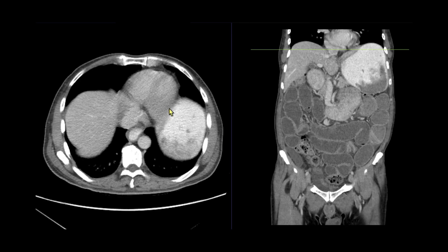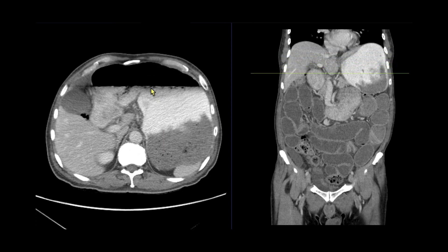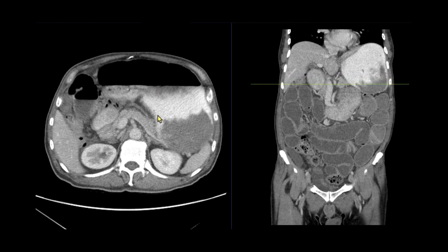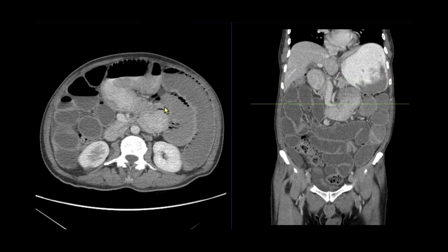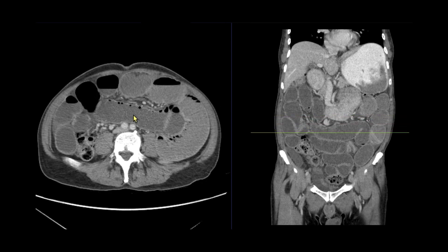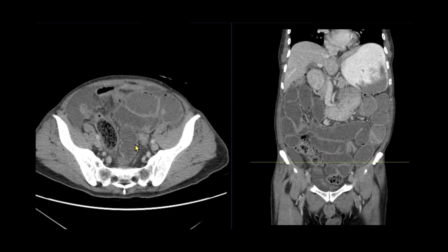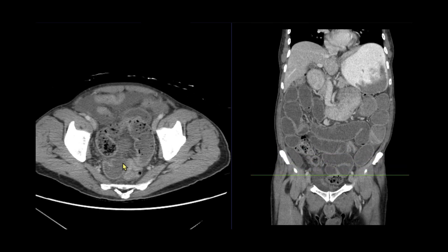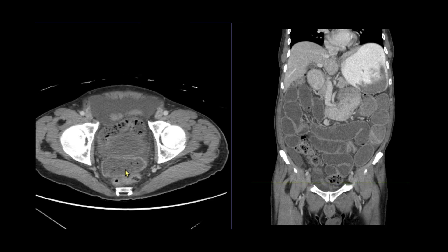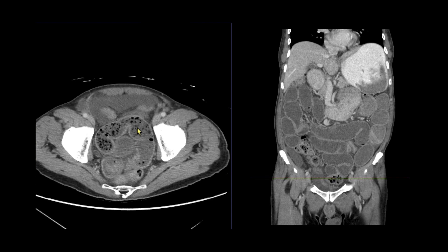Let's review this case and put our diagnostic skills into practice. Starting with the stomach, it is distended with food, oral contrast, and air. As we continue to scroll through the rest of the abdomen, it is distended with multiple dilated fluid-filled loops of small bowel. We'll continue to scroll into the pelvis and try to find a transition point. Here in the pelvis, we can notice that the contents of the small bowel change from fluid and now has dots of air within it, indicating fecalization.